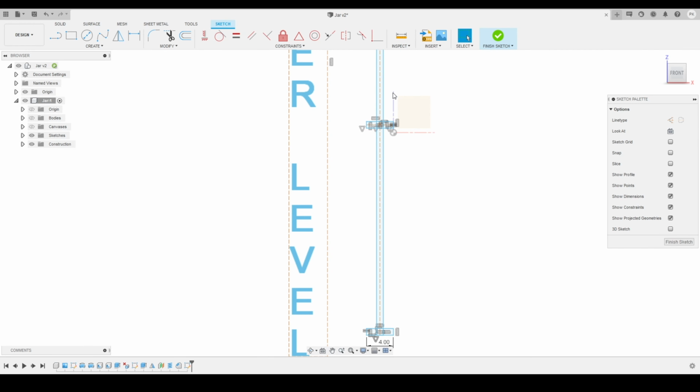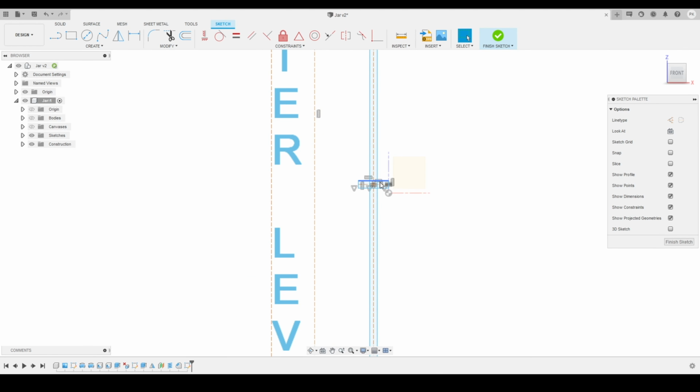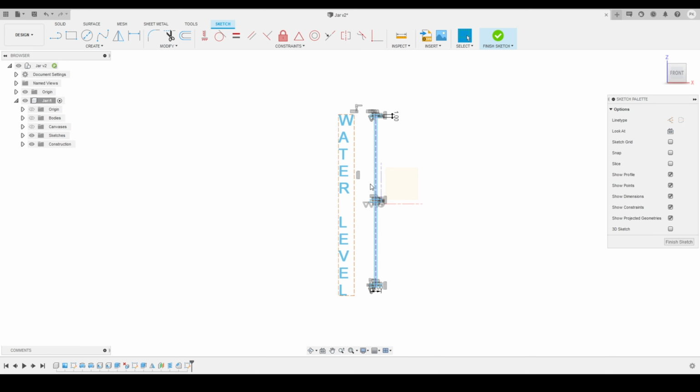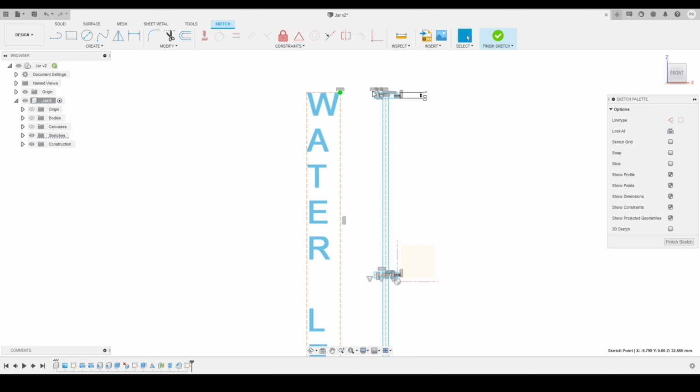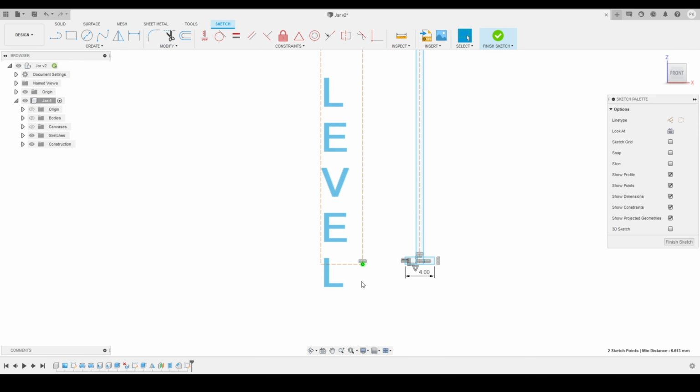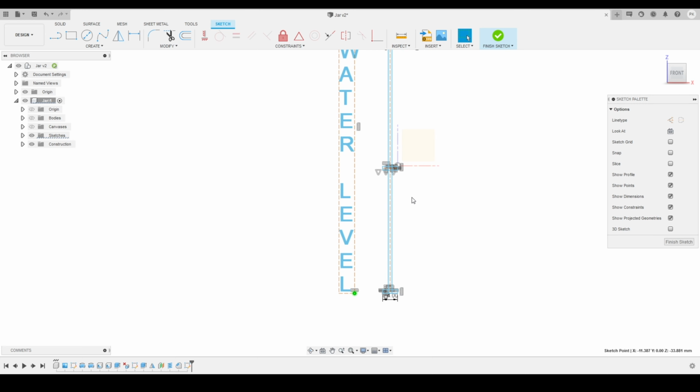So here you can see we had just created a few things. We had to adjust a few things, like we want this and this to be equal, so we had applied the equal constraint. And we had adjusted a few things, like we want this point and this point on the same level, so we had applied the constraint. Here you can see. Now if I adjust it a little bit so it will cover the whole text, it is looking good for now.